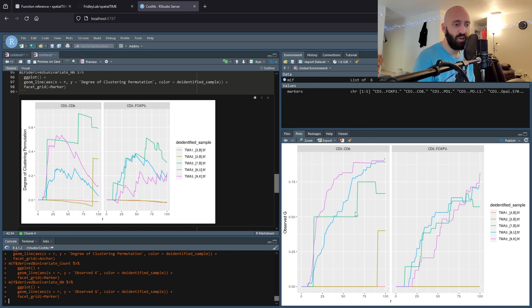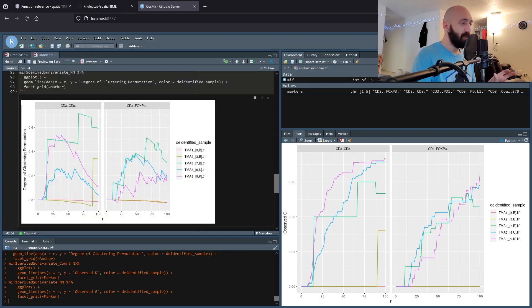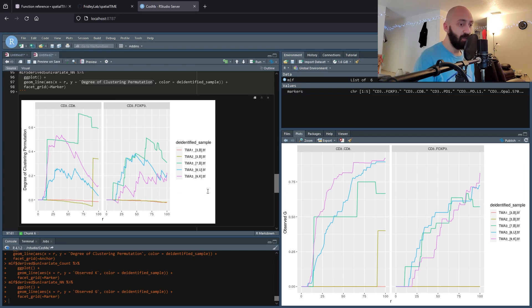We can see one sample's curve increasing while another drops off — likely due to edge correction. For FoxP3, similarly, we might say that 25% of cells in TMA3-9K have another FoxP3 cell within a radius of 45 pixels. The tricky part — and this is why I wanted to make this video — is understanding the actual values. When using these metrics, you want to use the degree of clustering permutation.